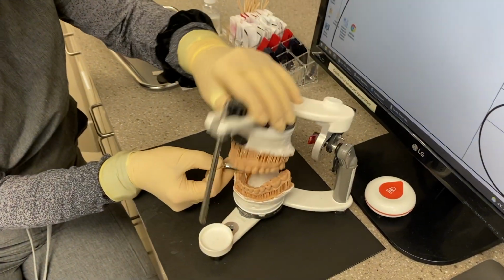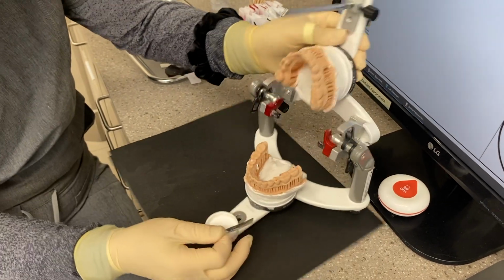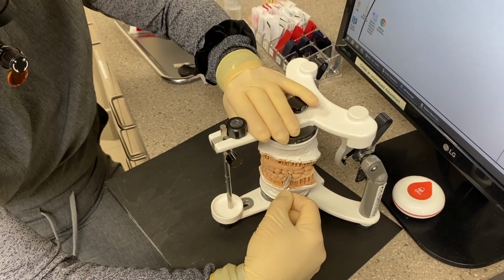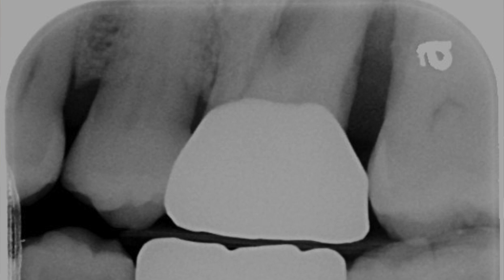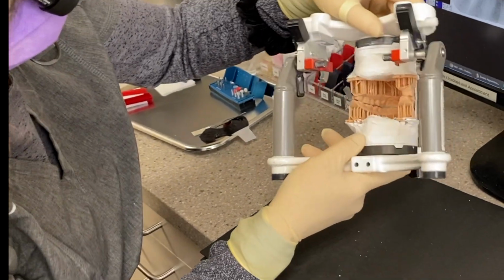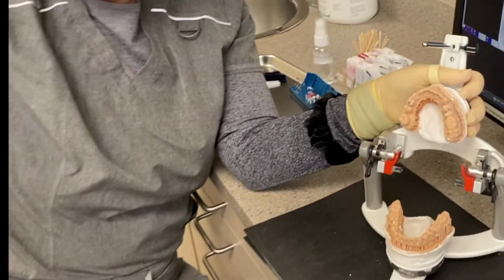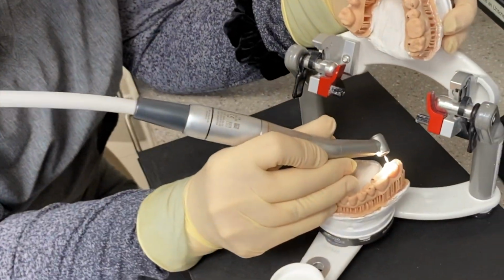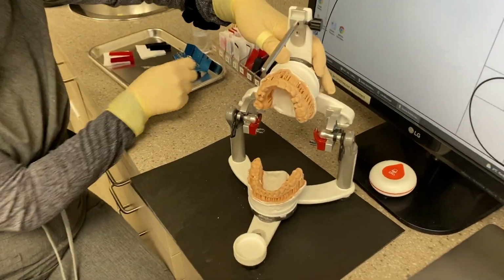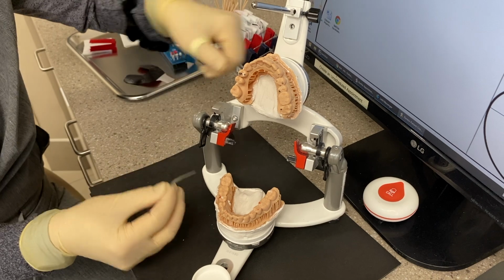And we're picking up other contacts now. This is better. Where are we at? Okay, and something here. And she had bone loss on, okay, it's the 7. I have a tug back on shim stock, so I'm going to just adjust that out. The benefit of mounting on articulators is you can see from behind where she's hitting. And again, it's the lingual incline of the 7 here. I'm basically doing the adjusting to see if I can do this in her mouth later on, so if I can duplicate these adjustments without doing a lot of damage to the teeth.